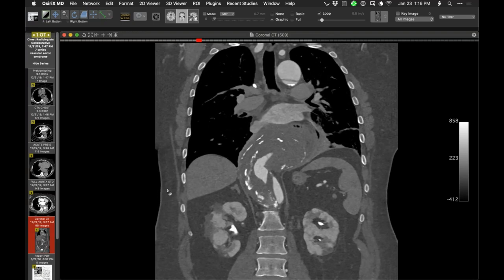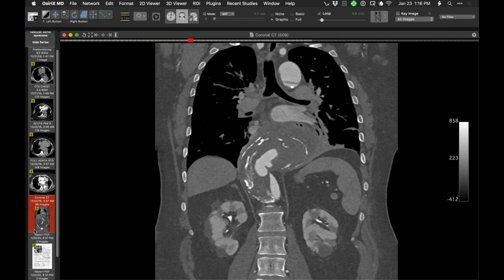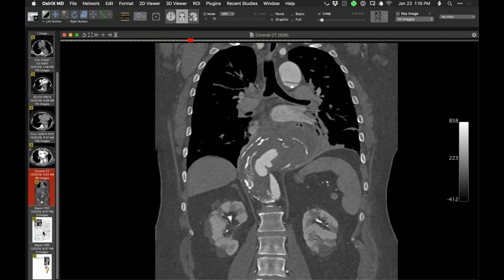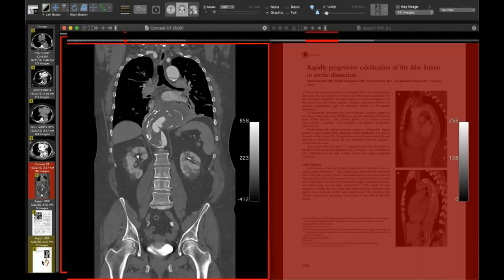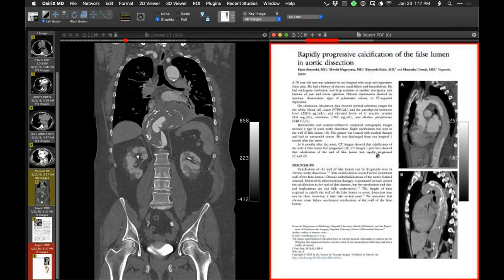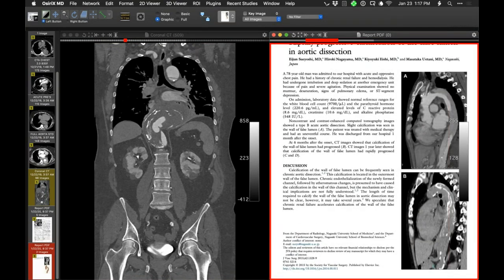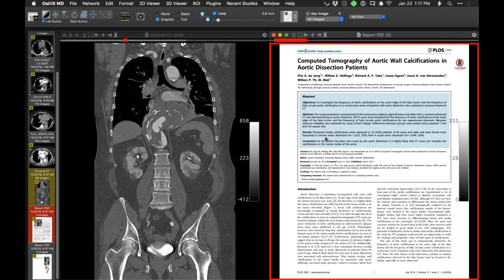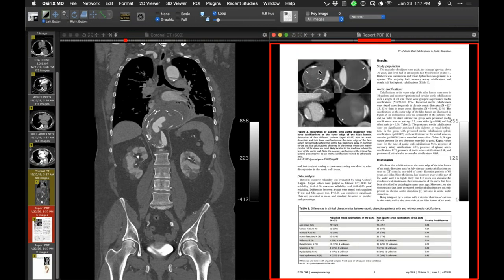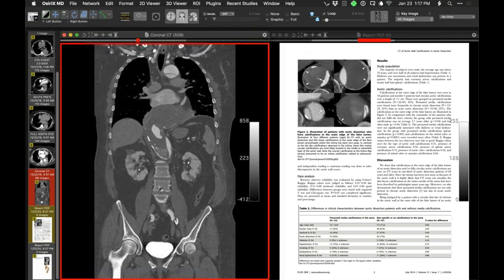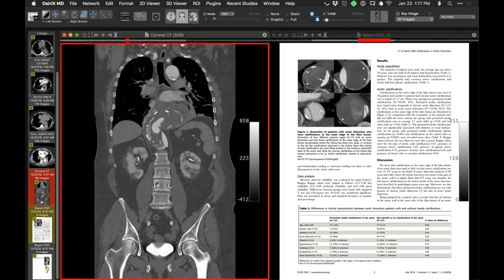This is a really dramatic example of unusual peripheral calcifications in a chronic dissection. I found a couple of articles describing calcifications like these in the context of chronic dissection — showing very similar calcifications, peripheral calcifications in the wall of the false lumen channel. This one's really dramatic in that respect. It does happen — I don't know why it happens, but this is a really dramatic example of it.